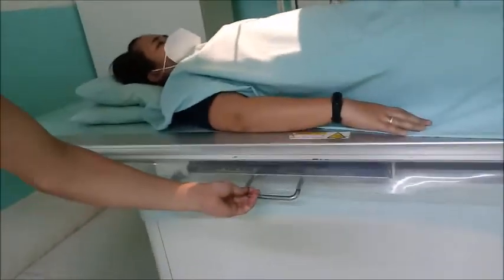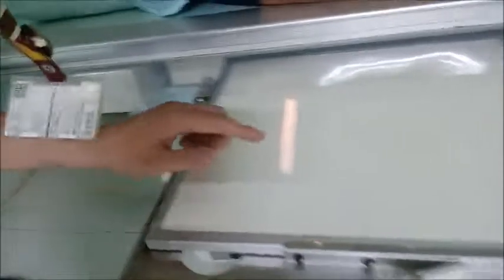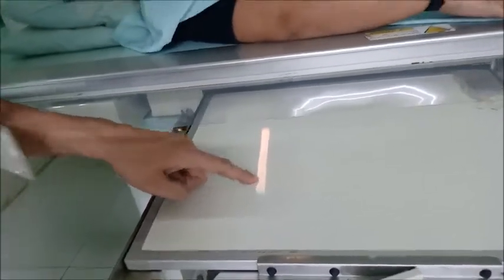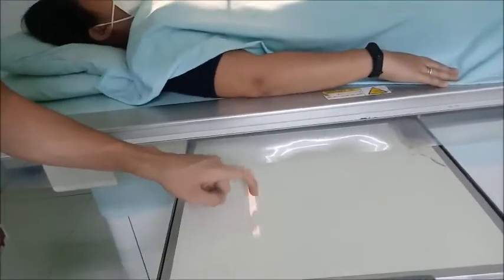So for the IR this time, nakato sa ato ang previous nga video. Remember the previous video? Kani bangag dire nga gamay na ay light nga gagawas dire. Kani siya. Kani siya nga light is mo niya makita dire. Kani siya. So that means kani siya nga linya, katong horizontal niya nga linya is also in line with this light.